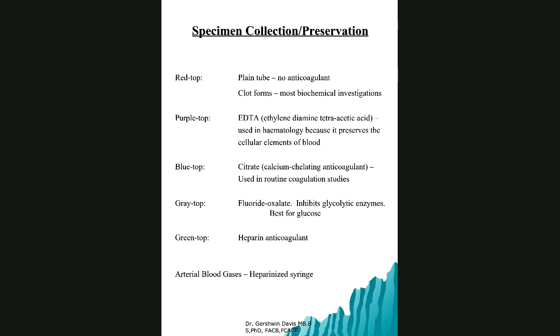You can't just use any old tube because you're analyzing for trace metals, small amounts. If the tube is not designed for trace metal analysis, you can get falsely elevated values as the needle of the syringe goes through the bung to put the body fluid in the tube. You can actually get contamination. So read up on other tubes, things like the black tube, the speckled tube.